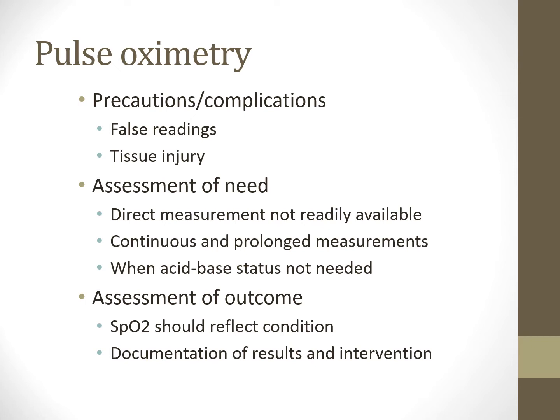Unless they had something like carbon monoxide poisoning or something like that, then we'd have to change it. Or if they were on a lot of nitric, then we'd still have to draw arterial blood gas to look at methemoglobin or co-oximetry, right? So co-oximetry would be one of your big things you'd have to be concerned about here.